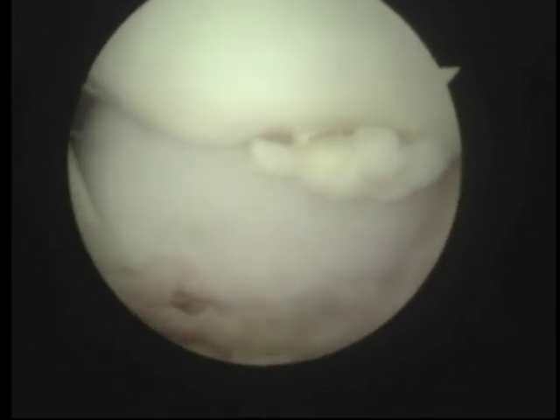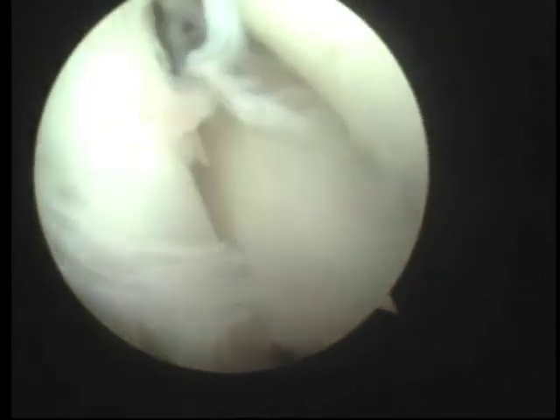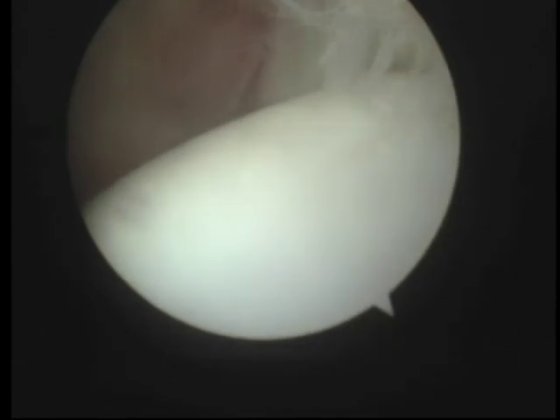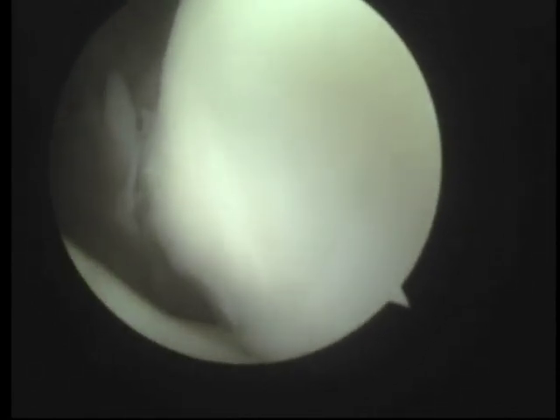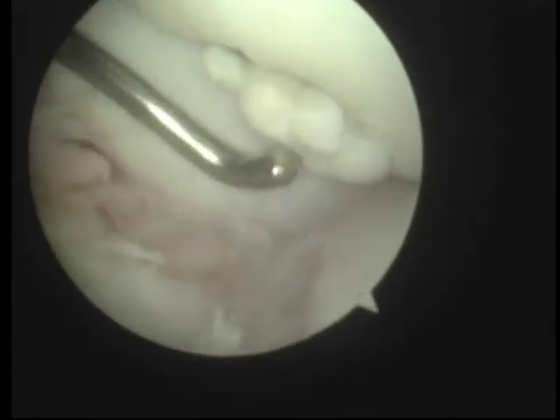You can see it's floating loose in space and it's not really on a weight-bearing surface, so they don't really do much damage to the hock, but because they're loose and floating about they cause the hock to swell up and cause mild - usually mild to moderate - lameness at high speed in racehorses, and perhaps some low-grade lameness in sport horses that may become worse over the course of years, because it sets up a very low-grade arthritis.